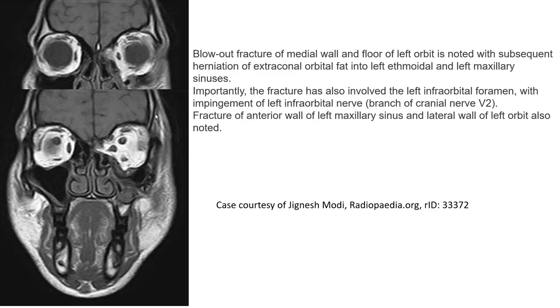The last case is an MRI image of orbital fracture, where we can see the blowout fracture of the medial wall and floor of the left orbit with subsequent herniation of extraorbital fat into the left ethmoid and left maxillary sinus.